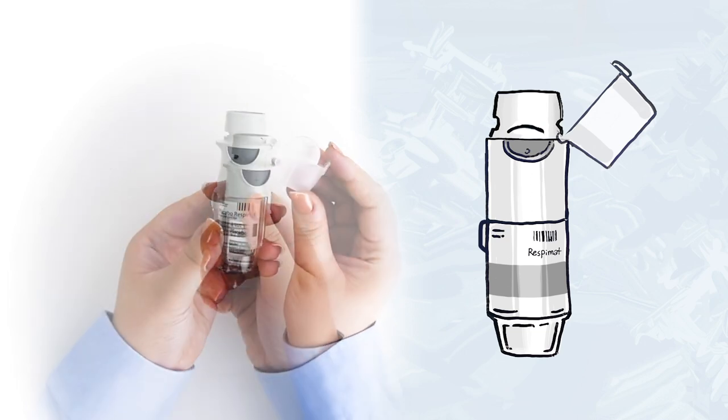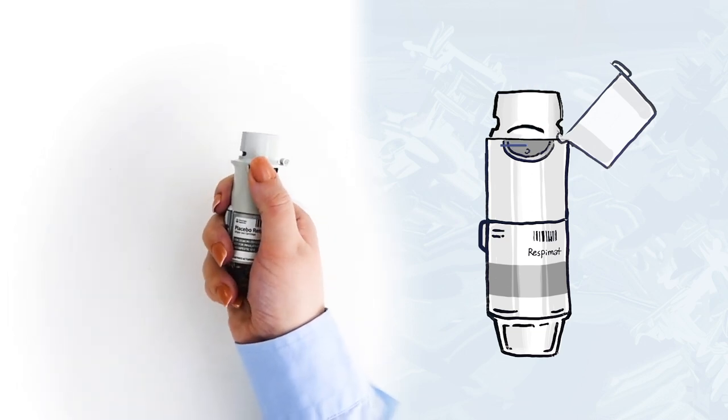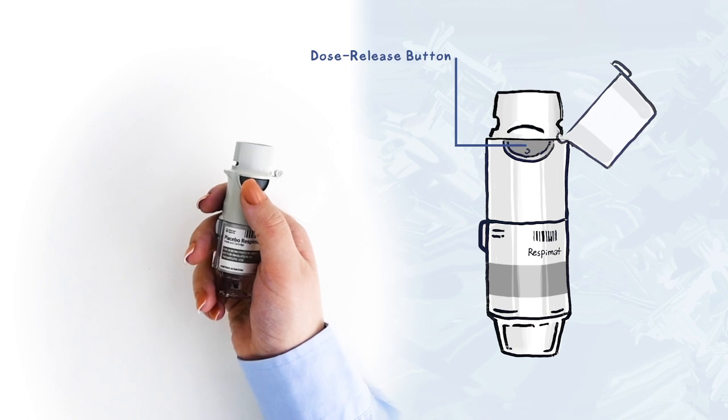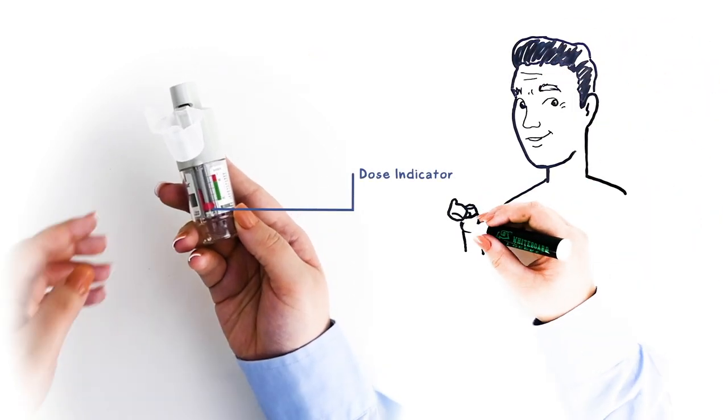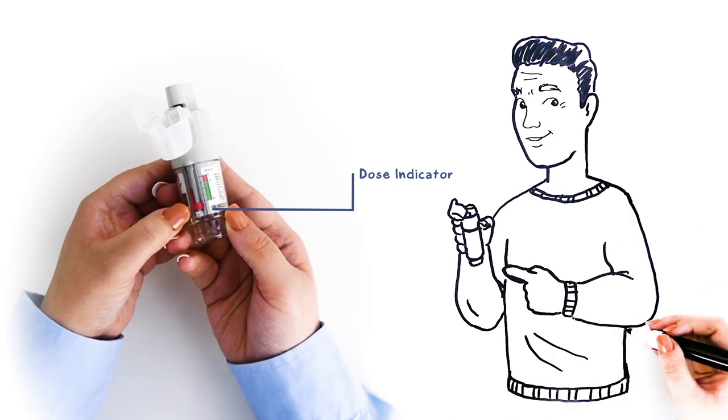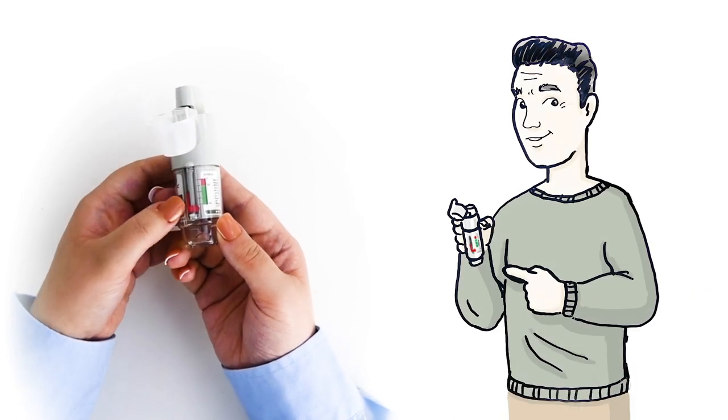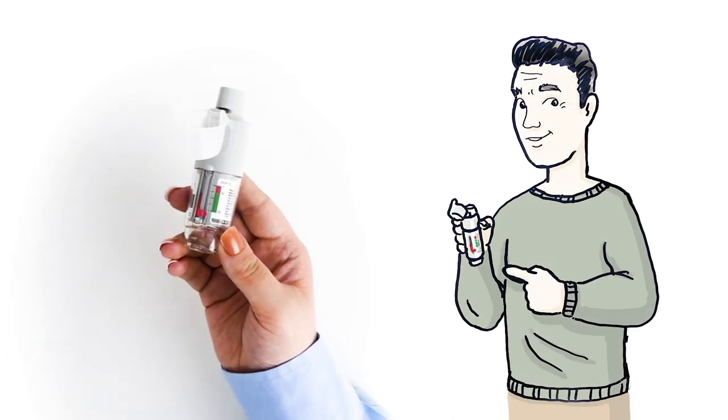The medicine is discharged as a soft mist from the medication cartridge when the dose release button is pressed. A dose indicator on the side of the inhaler shows about how many doses are left. When the indicator points to the red area, it's time to prepare your next inhaler.